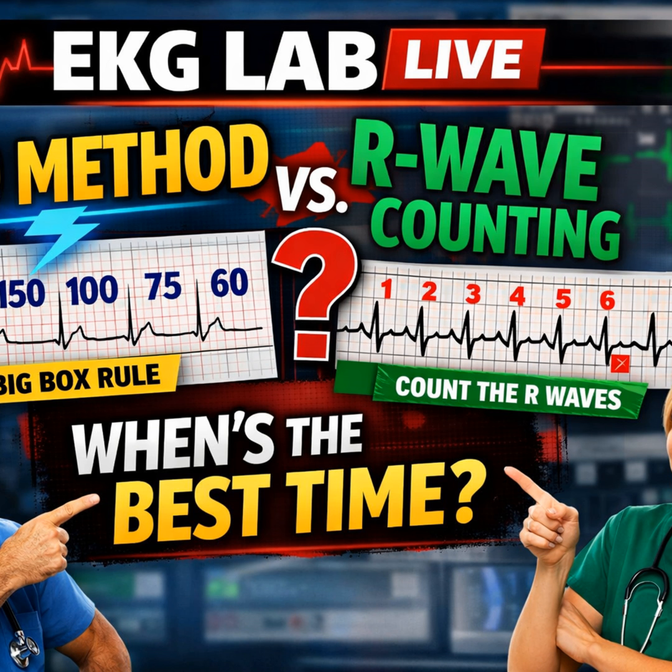I do, because you can't do the strip method without looking at the entire 6-second window. You are forced to scan the whole time frame to get your count. And in that scan, you're checking for consistency. You're seeing the context. You're less likely to anchor on one single clean interval and miss the ugly truth happening 3 seconds later. So you view the strip method as a tool for situational awareness, not just for counting. Exactly. It forces you to widen your aperture.